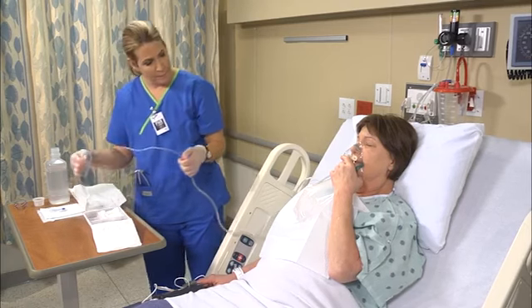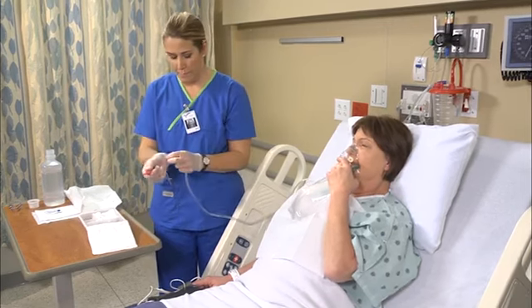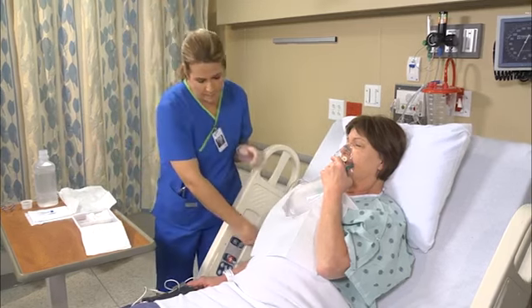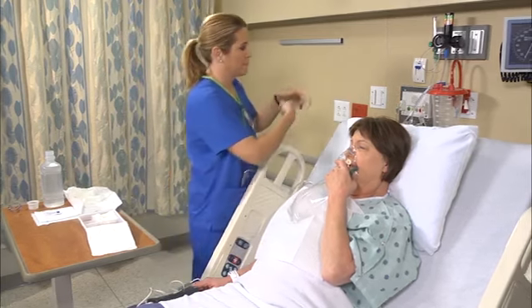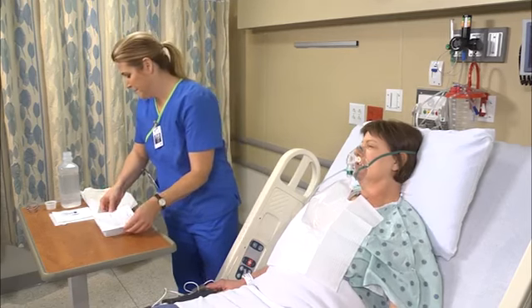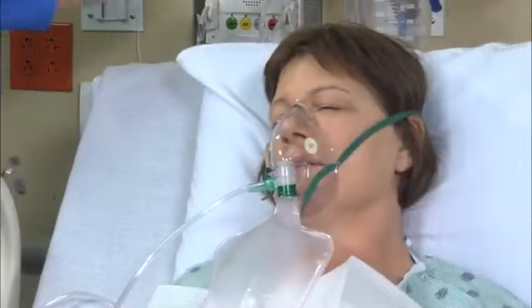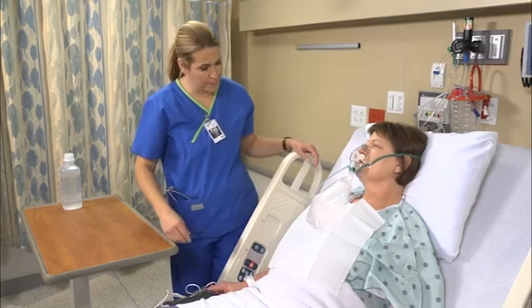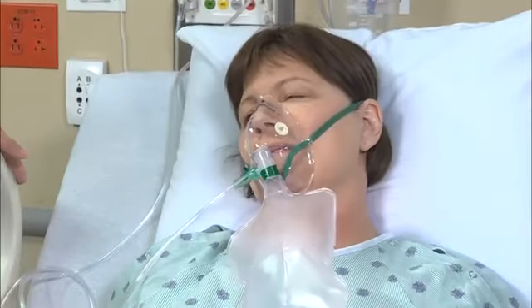When you've finished suctioning, detach the catheter from the connecting tubing. Loop the catheter around the fingers of your dominant hand and pull your glove off inside out around the coiled catheter to isolate any contaminants. Remove your other glove and turn off the suction device. Dispose of your supplies in the appropriate receptacle. If indicated, reset the patient's oxygen to its original level. Her blood oxygen level should have returned to baseline by now. Remove and dispose of the drape and reposition the patient.